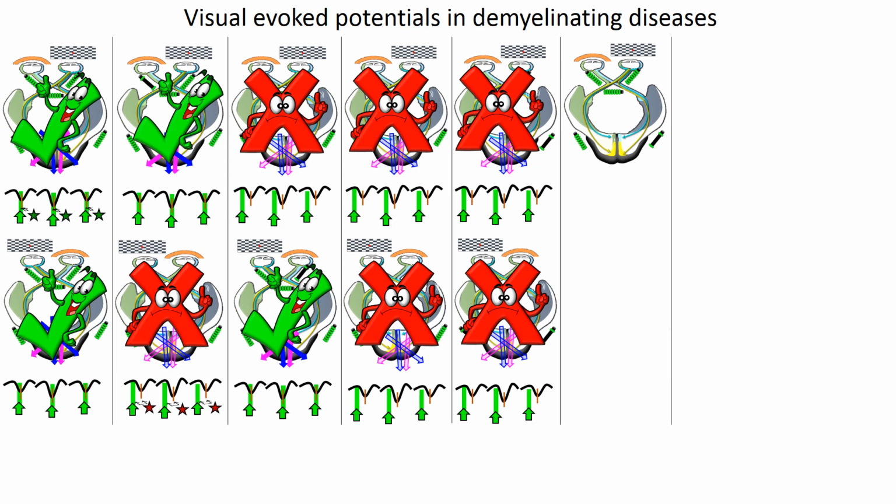I have now introduced a new figure representing right retrochiasmatic demyelinating lesions. The vectors that are delayed, represented by the partial transparent arrow, can be easily remembered if we put together the location of the lesion and the direction of the vector normally produced by the occipital cortex following activation. Right occipital lobe activation produces vector directly towards the opposite side and the midline. Thus this vector will be delayed, while the vector produced by activation of the left posterior lobe in blue will be normal.